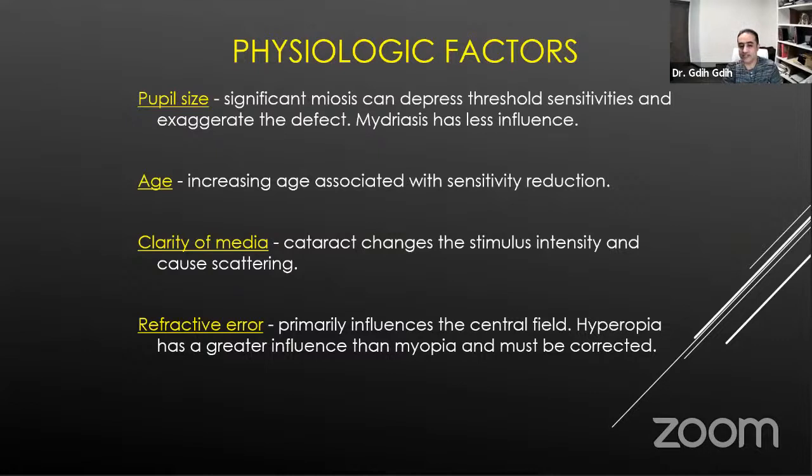What it does is the machine will memorize the patient's refraction and dial it in automatically. You don't have to even spend time on that. So that's quite nice to have.